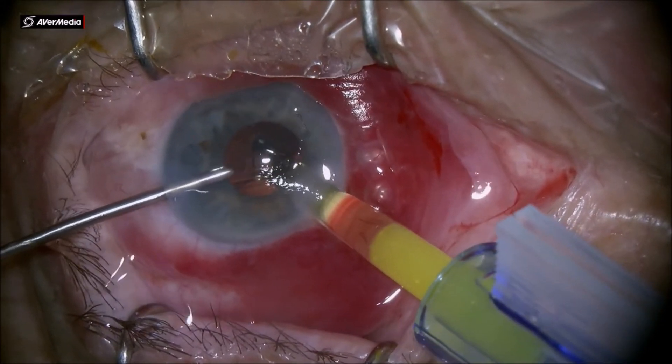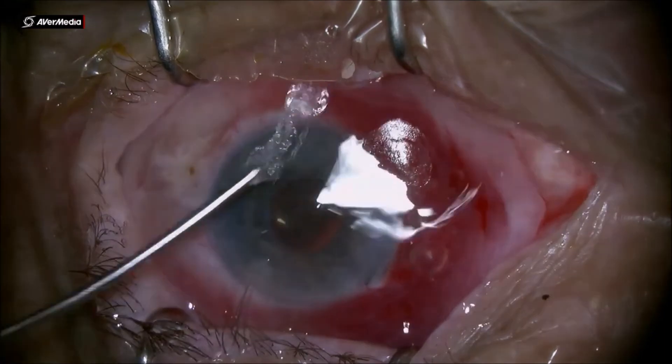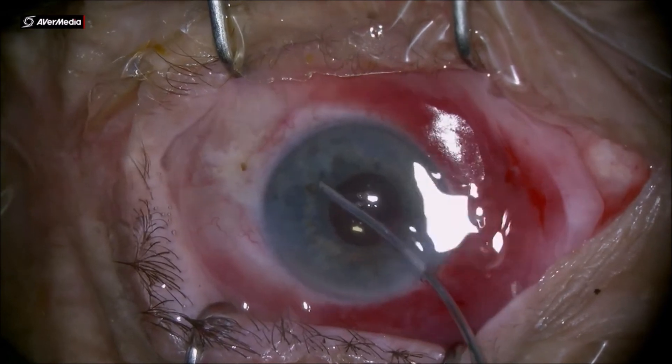Injecting the IOL under irrigation straight into the bag is very easy, and at the end cleaning up the anterior chamber from any viscoelastic and pushing back the iris root. Thank you for your time.